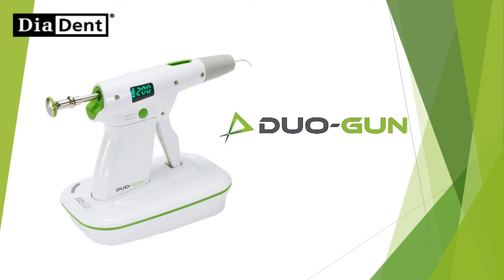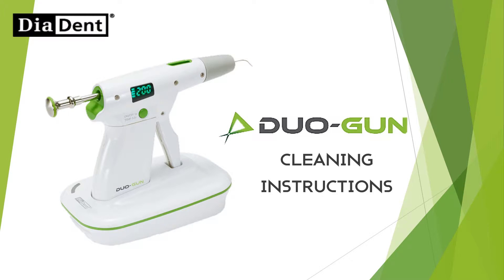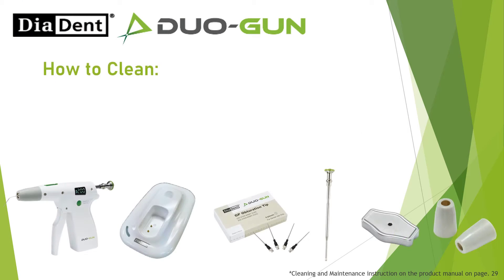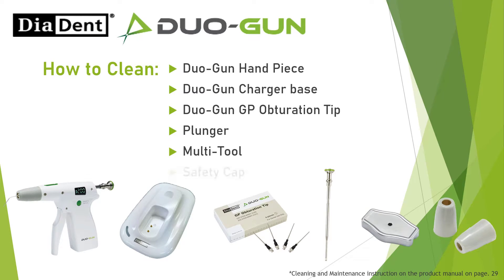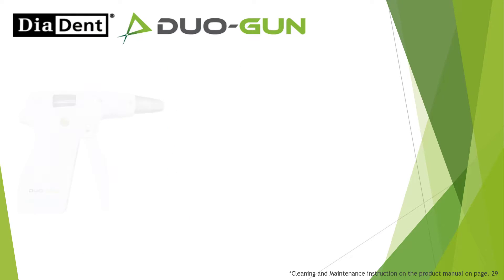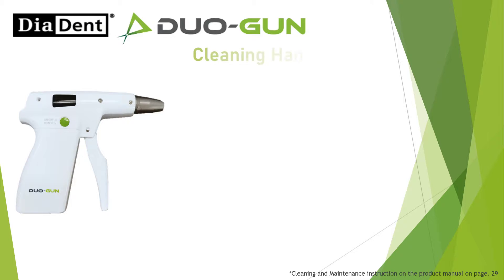Duo Gun cleaning instructions. How to clean: Duo Gun handpiece, Duo Gun charger base, Duo Gun GP obturation tip, plunger, multi-tool, and safety cap.